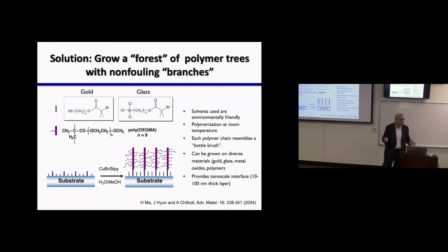What you get are clumps. You never get a complete forest. If you want a forest of PEG, because once you have a forest of PEG, proteins will approach the surface, they'll see the PEG, they have no energetic reason to bind. So thermodynamics are not favorable, and they will simply stick and then leave, get desorbed. If you want a forest, do what nature does, plant seeds and grow trees.